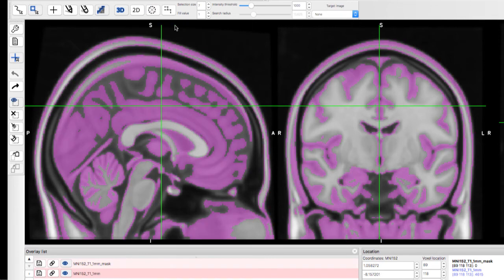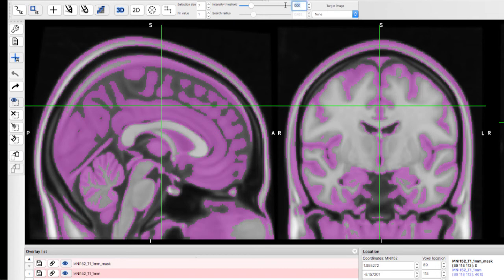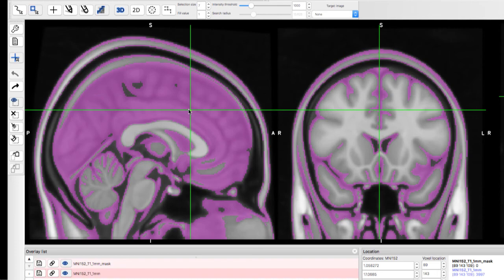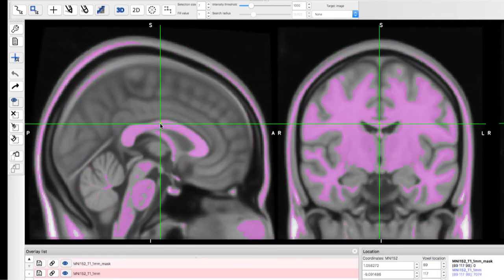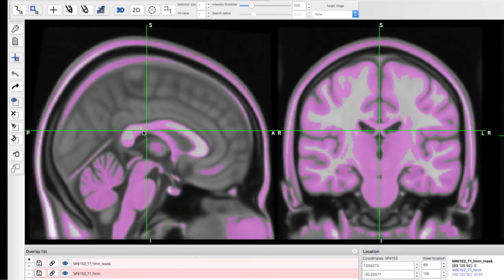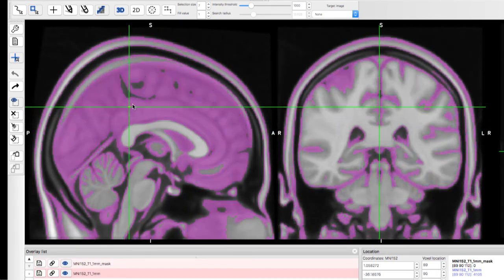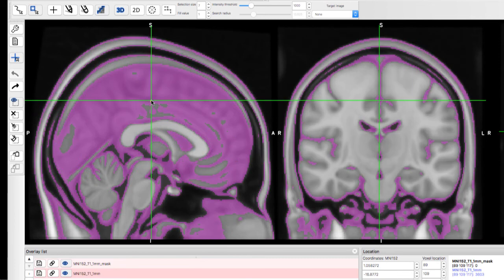Highlight the parent image and unselect the Limit to Radius button. Set the intensity threshold to 1000. Selecting a voxel will highlight neighboring voxels in the brain that are within an intensity range of plus or minus 1000 from the currently selected voxel.